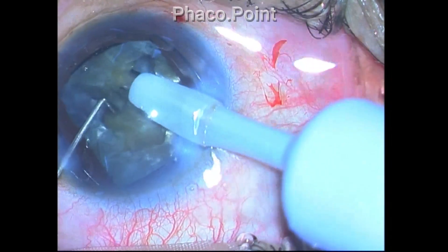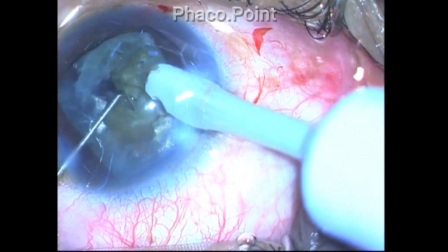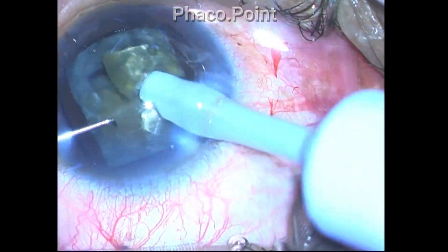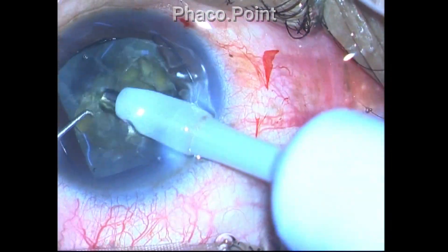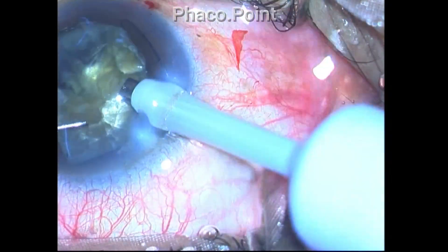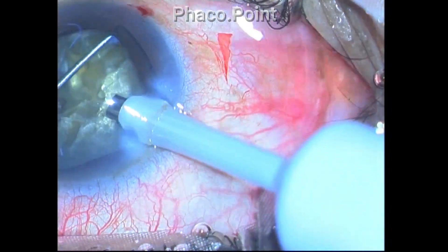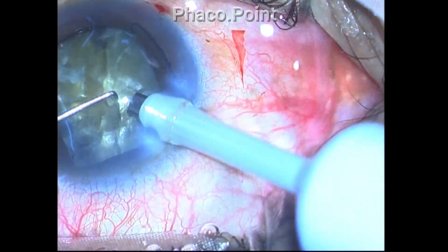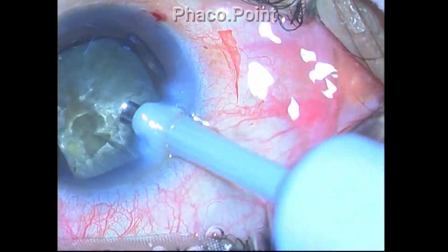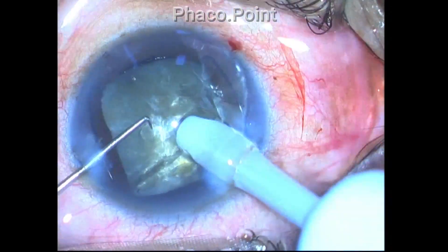If the exposure of the phaco tip is not enough, you will not achieve adequate depth, making it very difficult to create a through-and-through chop. The key message: in harder grades of cataract, expose the phaco tip to at least two to three millimeters so it can penetrate to the midpoint of the endonucleus. In very hard cataracts the endonucleus can be five millimeters, making the midpoint two and a half millimeters deep.